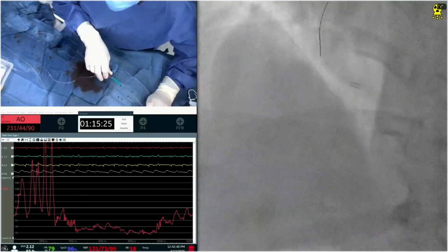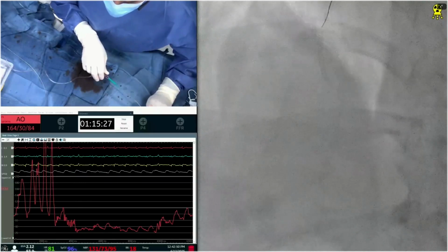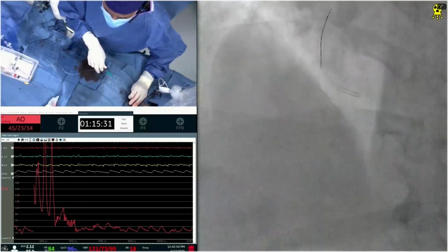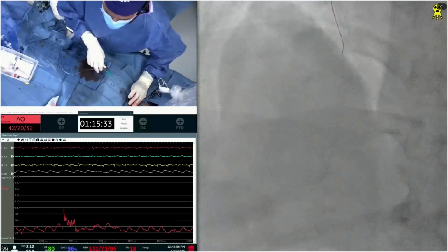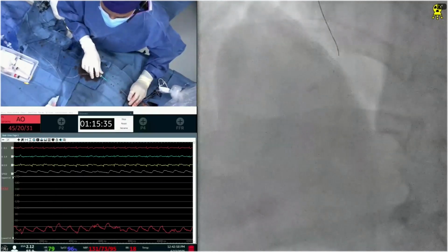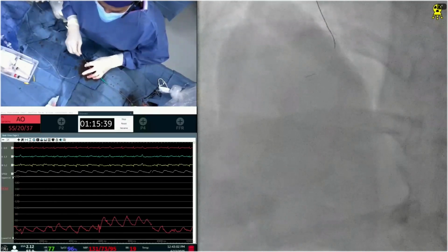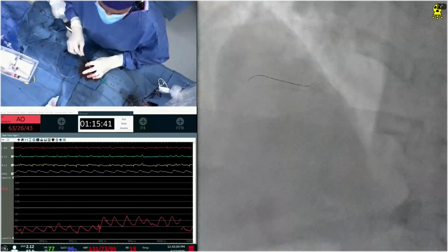We still have our AL 0.75. Deepak said maybe that's what will fit a little better now compared to what it did earlier. That's a great point. I mean, equipment fatigue is a real issue. Yeah, when you're pushing this hard on things, you could lose your backup and support.